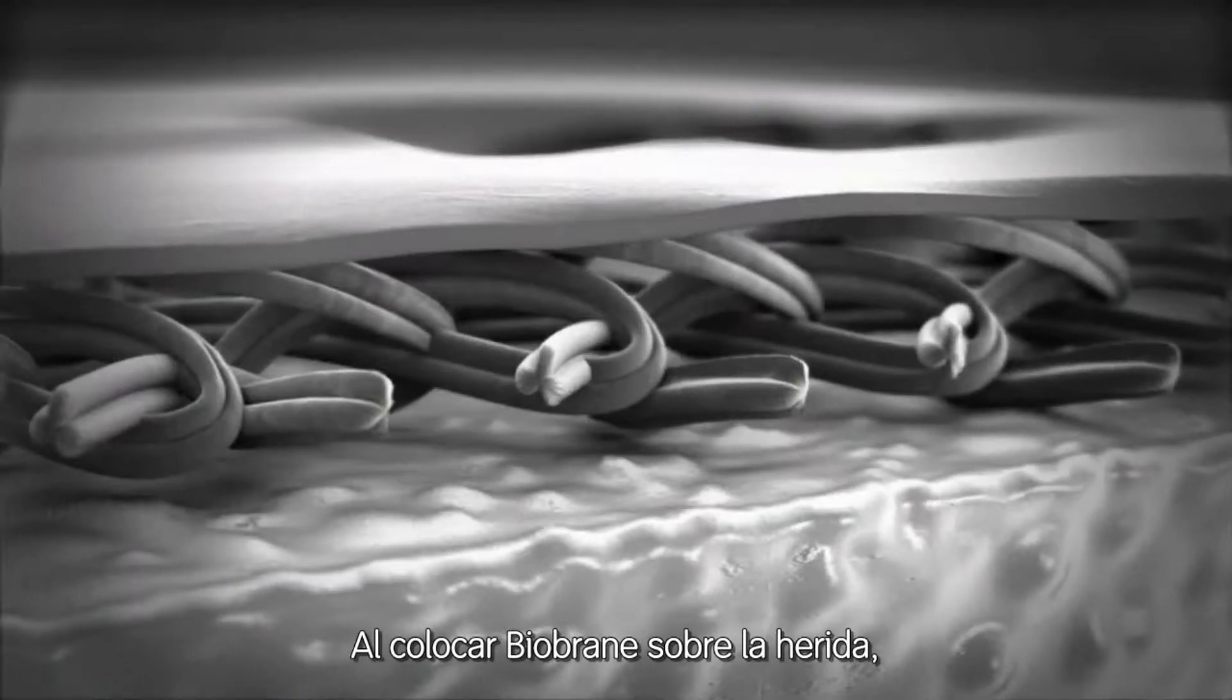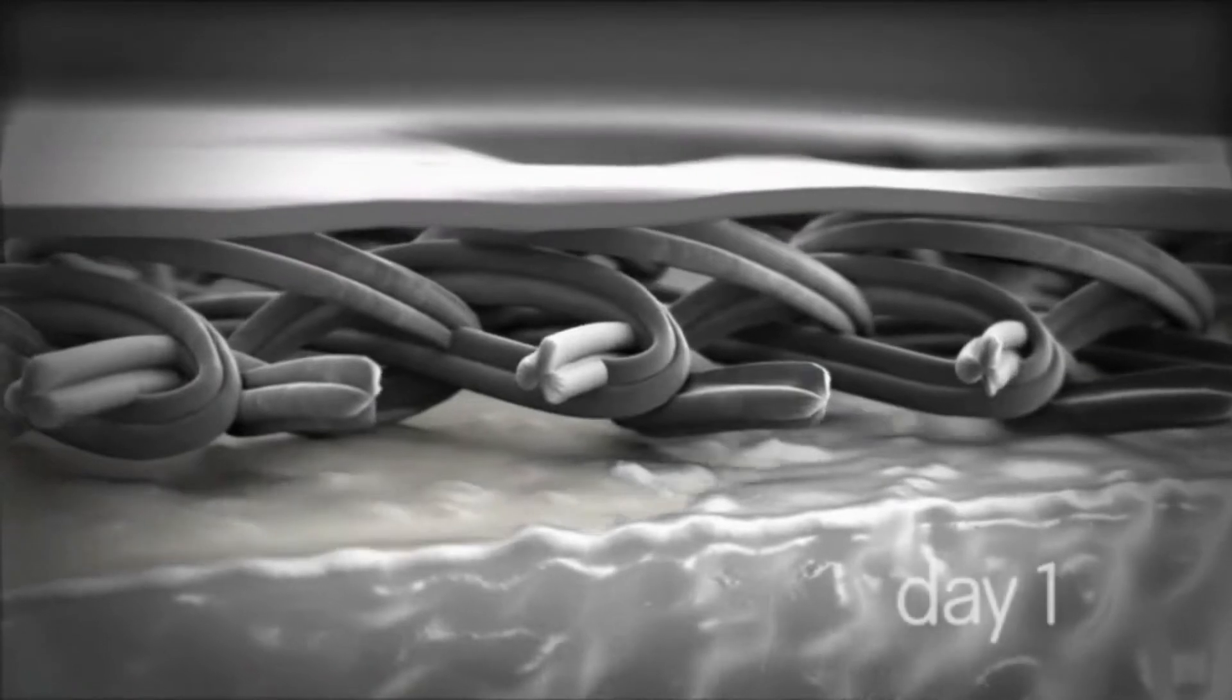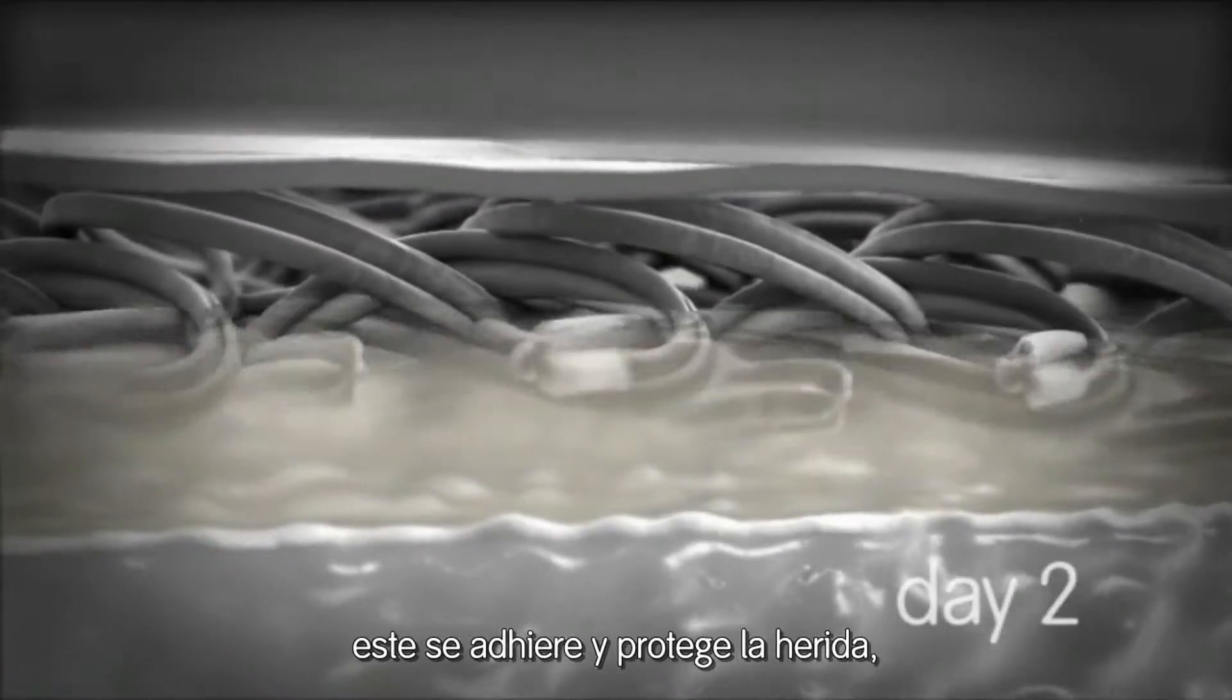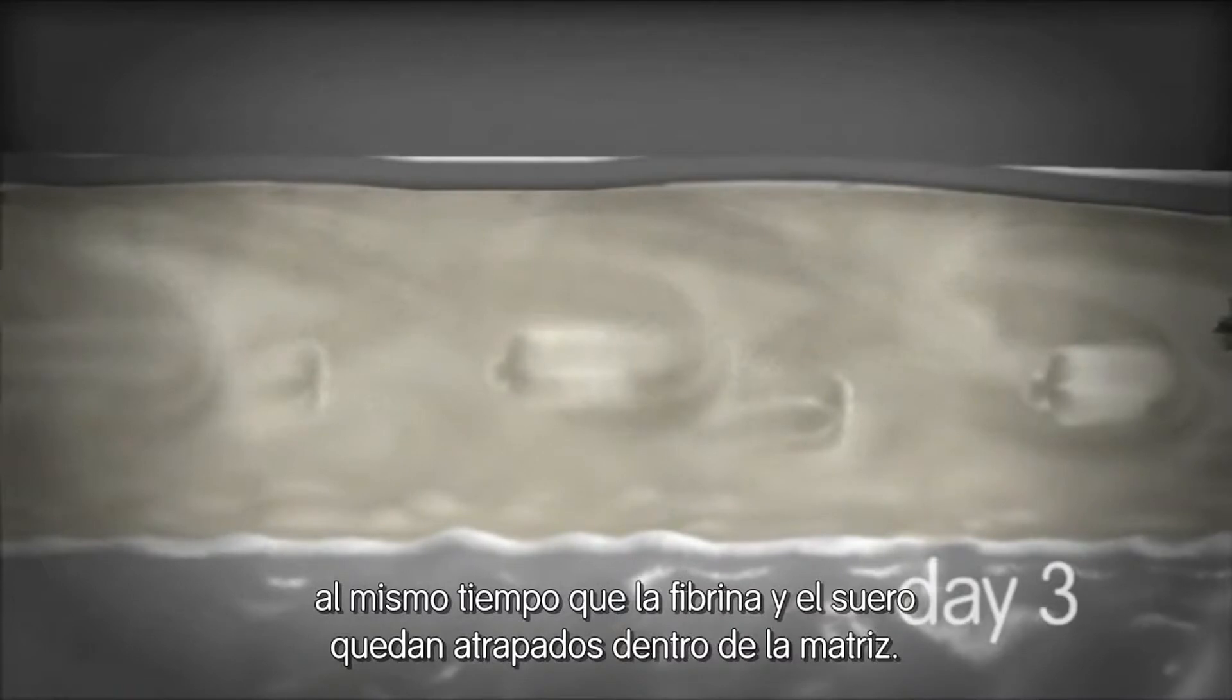By placing Biobrane's fabric side onto the wound, it will adhere and then protect the wound as fibrin and serum are trapped within the matrix.